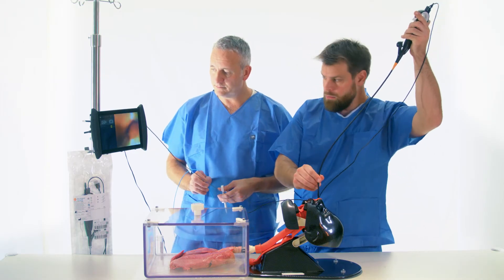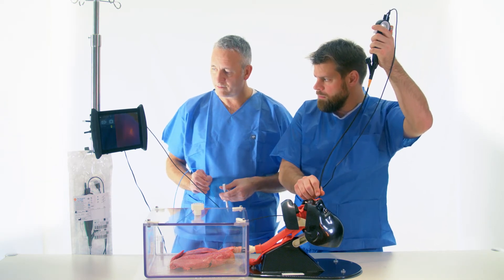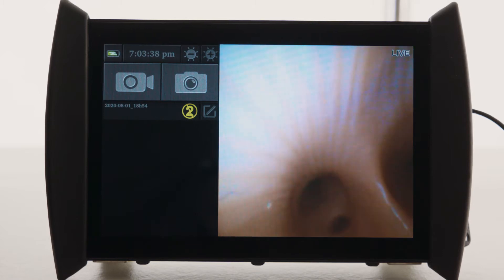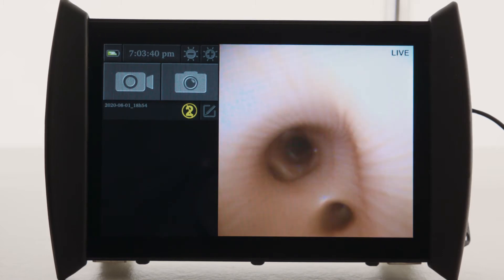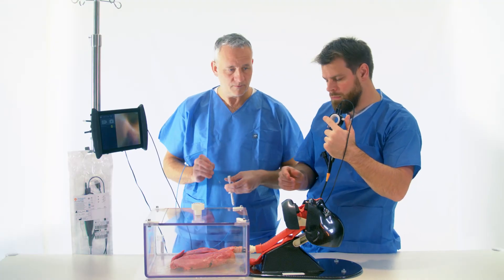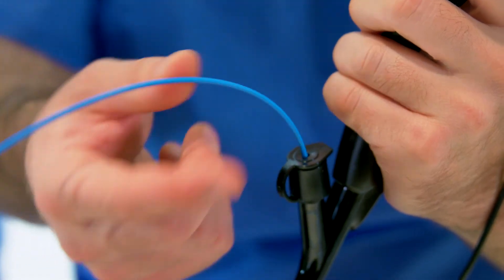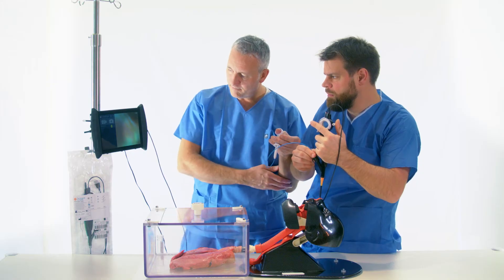A BroncoFlex Vortex is used. Its large working channel of 2.8 mm offers compatibility for tools with a diameter of up to 2.6 mm. When the region of the biopsy is reached, the forceps are introduced through the sealed biopsy valve, making sure the forceps are closed.